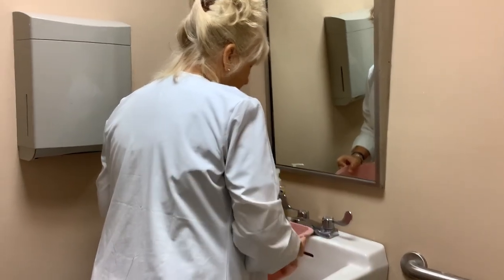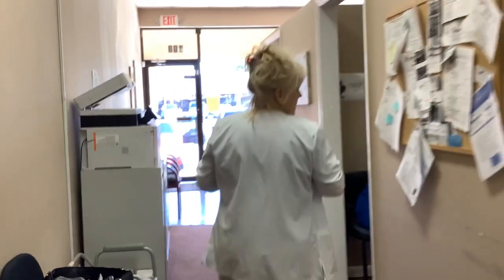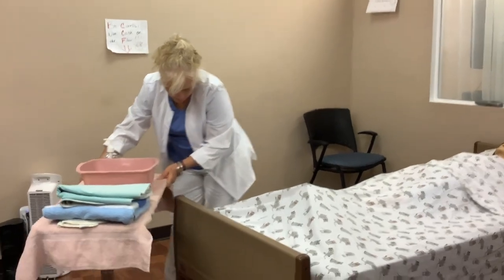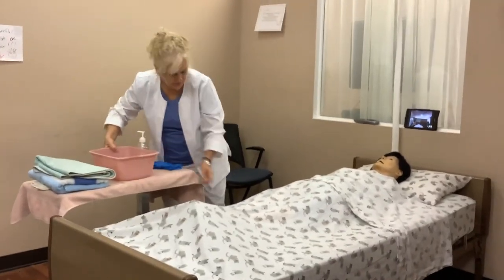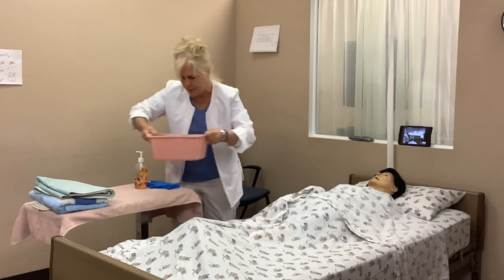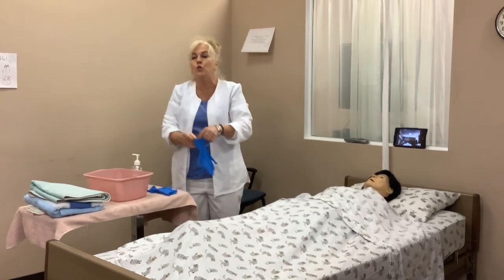Turn it off, garbage. We might take gloves to go — anything else, you can ask her. Okay, Mrs. Smith, do you want to test the water? She tested the water. So right now, be sure the gown is down. Right now, put my gloves on because I want to start on the patient's skin.